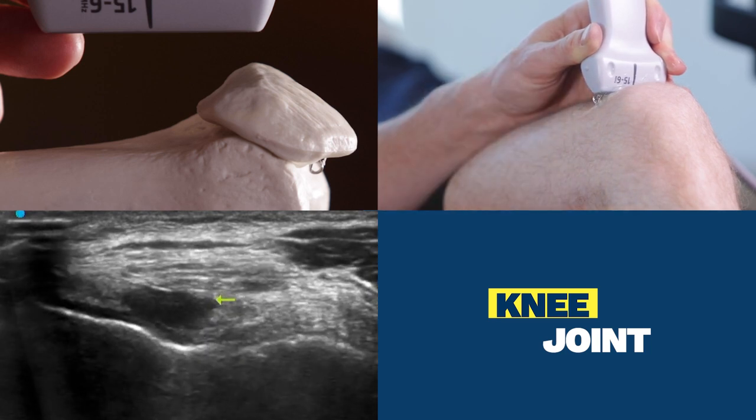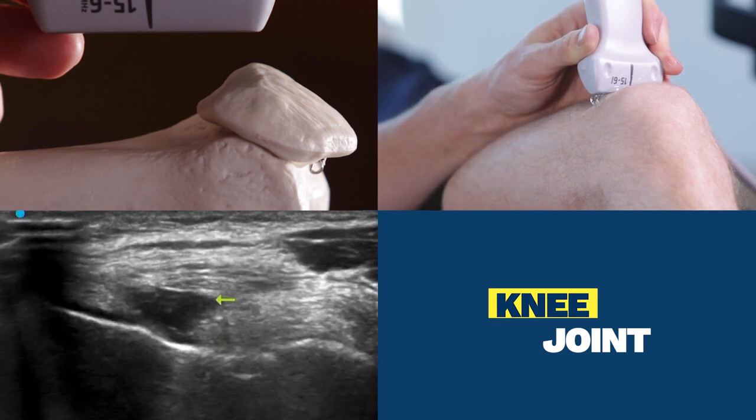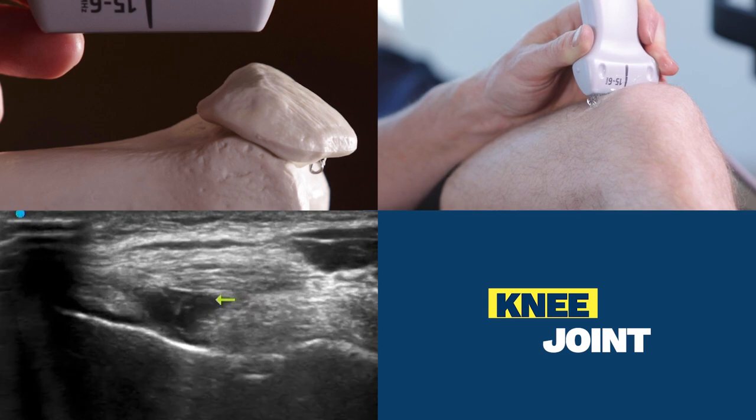This is a normal amount of physiologic fluid within the suprapatellar recess, and in cases where there's less fluid than this, there's an alternative injection angle under ultrasound.